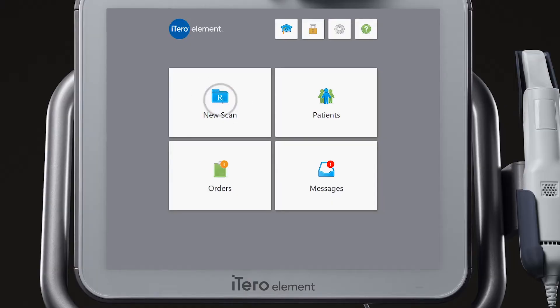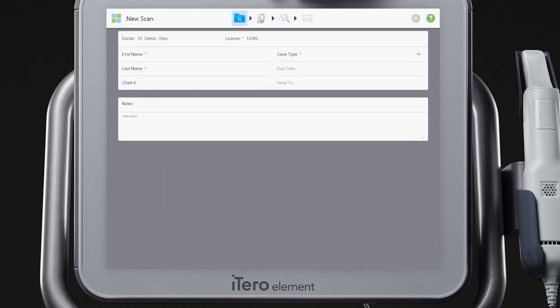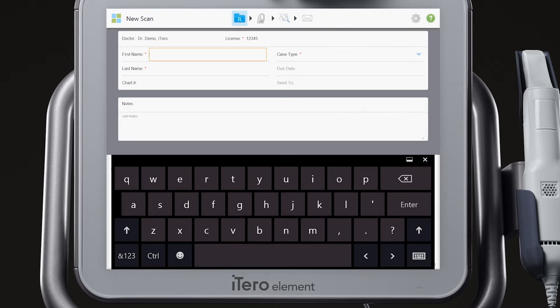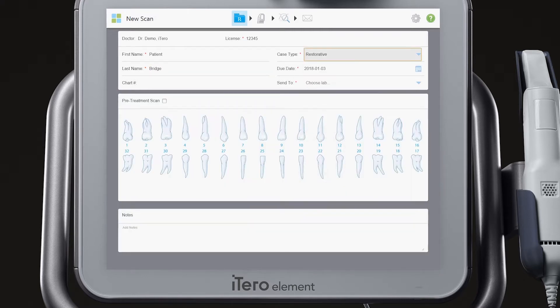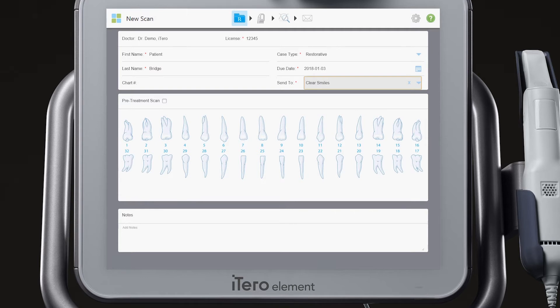Choose New Scan from the home screen. Complete the required information in the Rx: the patient's first and last name, case type, due date, and the lab the case will be sent to. The required items are identified by the red asterisk.